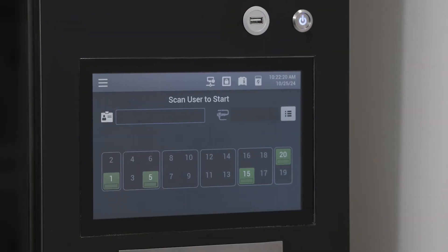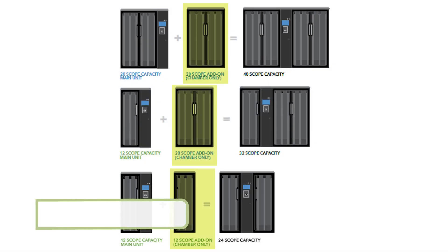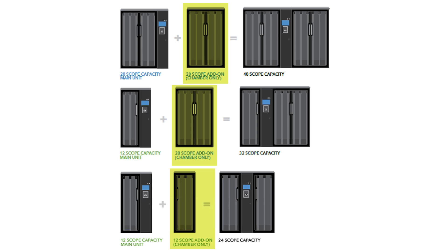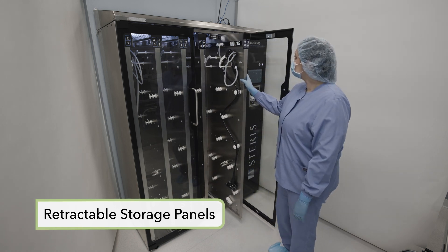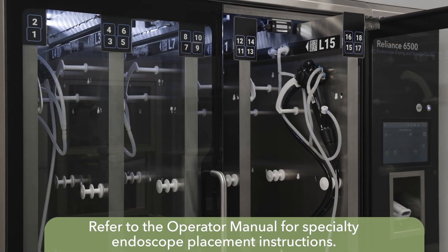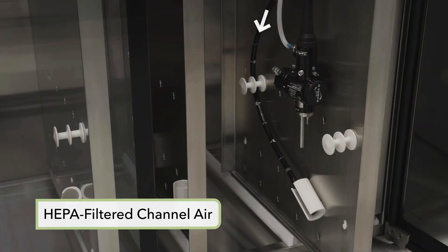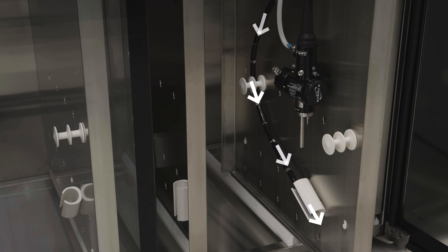Integrated into the main cabinet is a control unit which incorporates the user touch screen. Optional cabinet expansion modules are available to increase storage capacity by 12 or 20 scopes. Retractable storage panels allow storage of a wide range of endoscopes and can be configured to meet the facility's requirements. The panel incorporates a manifold into which the endoscope tube set is connected to provide channel purge air. A separate HEPA filtered air supply provides channel purge air to support the drying of endoscope channels when connected to the endoscope with an appropriate tube set.